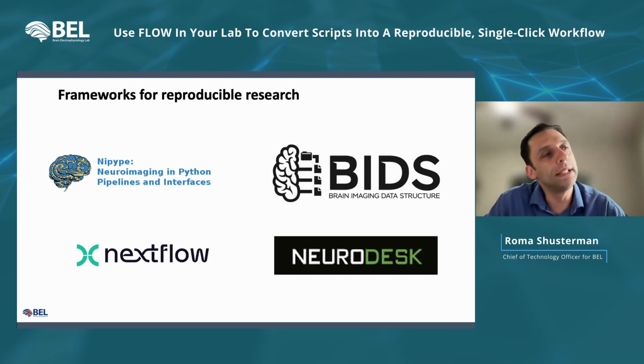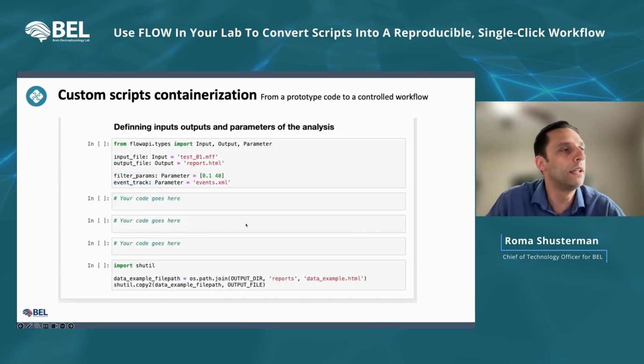Most of them still require some software engineering capabilities to establish this in a lab. And that's where, when we decided to work with containerized notebooks, we thought about how to make this very user-friendly. And we came up with the following idea.